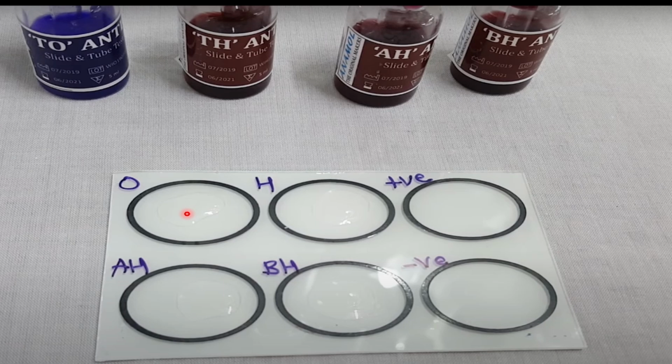From this serum, what will we do? We'll put the drops of serum on these 4 slides. So we'll put serum here, here, here, here. After we put the serum, wherever the O is written, you put the O antigen there. Wherever the H is written, put the H antigen there. Here AH is written, so you put the AH antigen here, then we have the BH antigen, you put the BH antigen here.